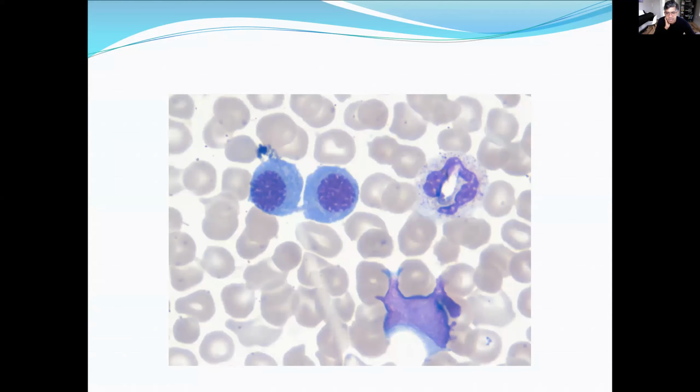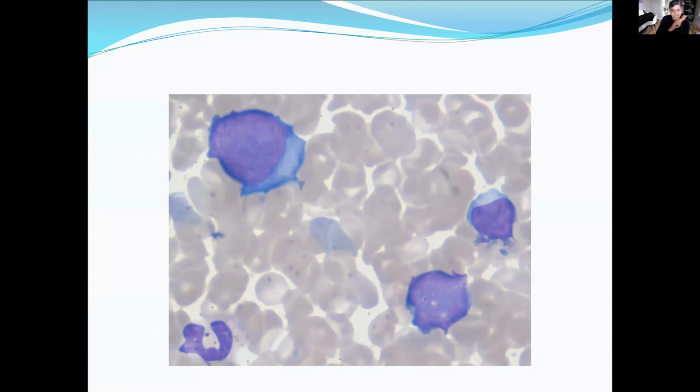There are two cells there, which we would call nucleated red cells. Yeah, and there's a blast. That's our favorite neutrophil. These are also funky looking blasts. There is a large blast with basophilic cytoplasm with almost something that looks like blebbing. And there's some more blasts with high N:C ratio, blebbing. And this is our lymphocyte there for comparison. So see the size, see the chromatin. There's a difference between the two.